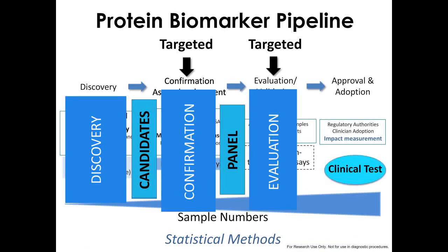So now, what I've highlighted here is that using this targeted approach, we can confirm whether the candidates do indeed increase from our discovery cohort of patients, and we can then use this MRM approach to evaluate the clinical performance of a panel of proteins, and I would say move us 2 steps further towards developing a clinical test. So we're perhaps reaching Camp 3 on our climb up Everest to a clinical test.